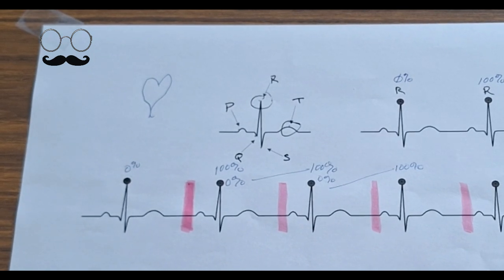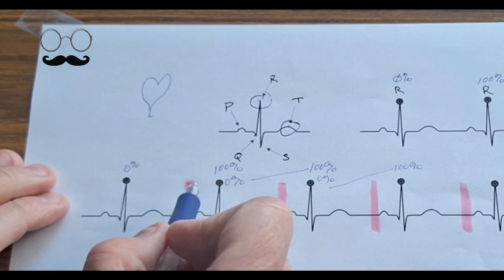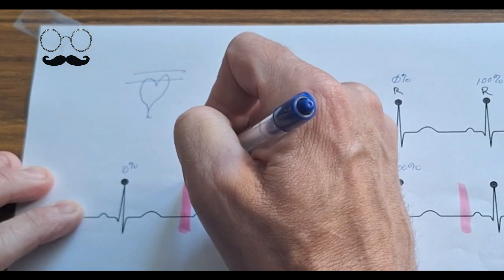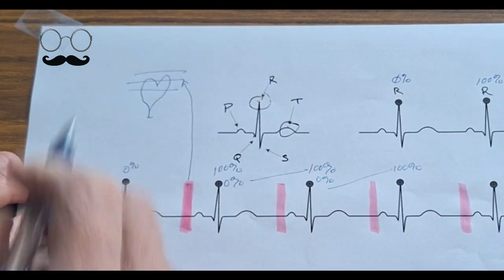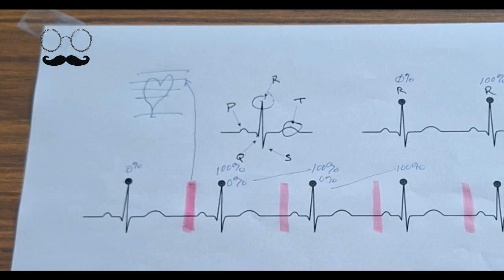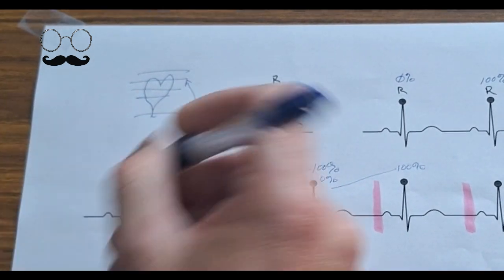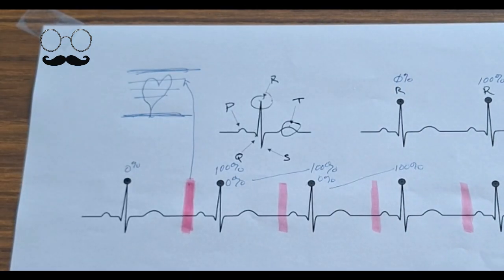You'll have more beats, less beats. It's also depending on the length and size of the heart. But how that works is the computer takes this data set here, and that will be the top portion of your heart. Then you'll have another beat with another scan. That'll be your next one, and then your next one, and then your final one. So each one of these will go to a section of images, and then your system will put it all together. However, if you have a system that can do it all in one beat, let's pretend this is our single beat, then this would cover all the tissue of the entire heart in one beat cycle.